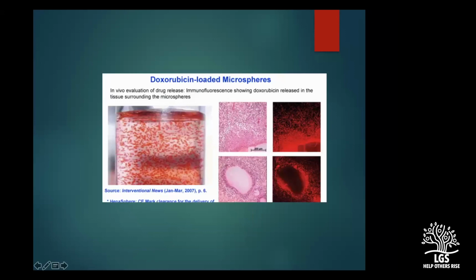drug-eluting beads. What you see is the doxorubicin and the beads suspended in a solution. When we inject this, it blocks off the vessels immediately. And that is the reason, when we are not certain about the location of the tumor, sometimes you get this wishy-washy appearance on the CT scan. You're not really sure where the tumor is and what is supplying it, whether this is a tumor or not. You have a lot of doubts when we look at certain CTs. And when we have such a scenario, it's better to avoid DEB-TACE.